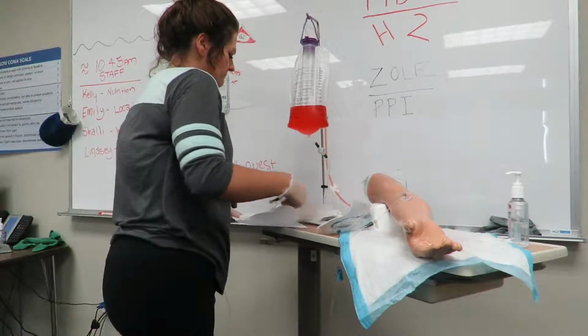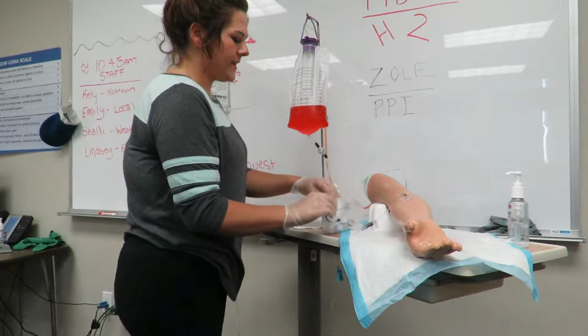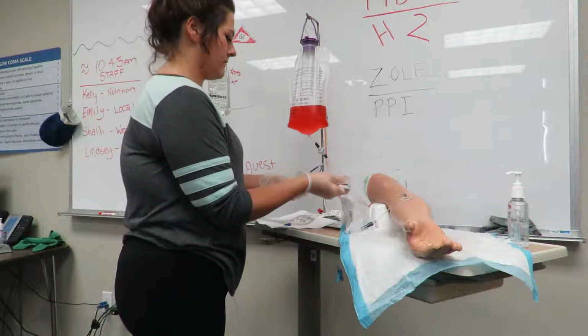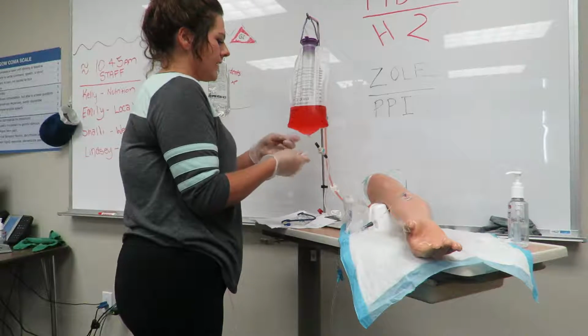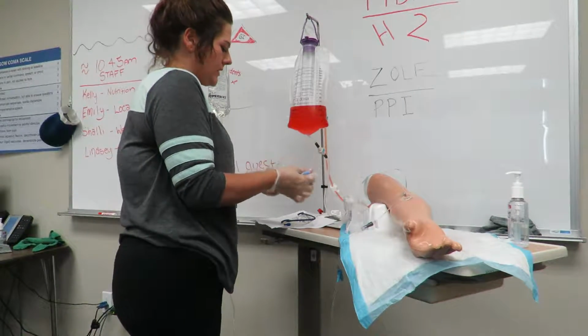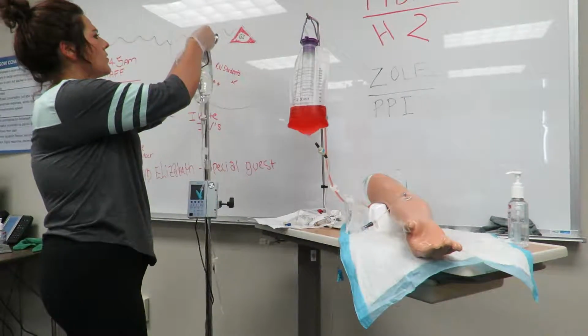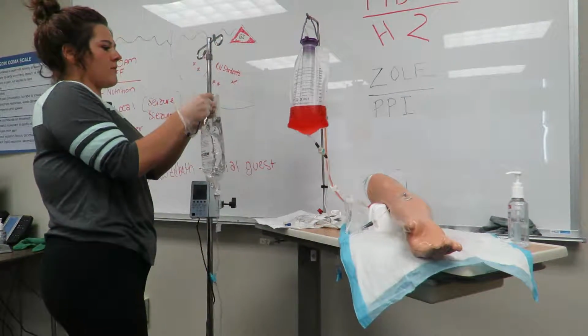It's open. And open up my tubing. And the first thing I'm going to do is I'm going to close my clamps on my tubing. Good. I'm just going to go ahead and lower my bag here.